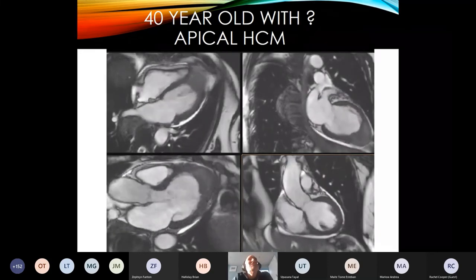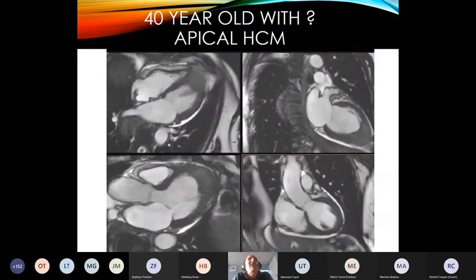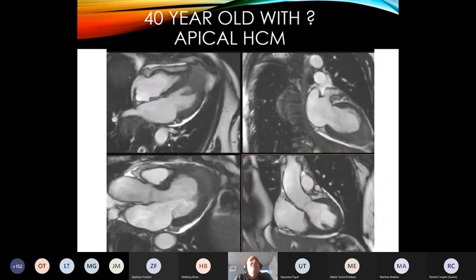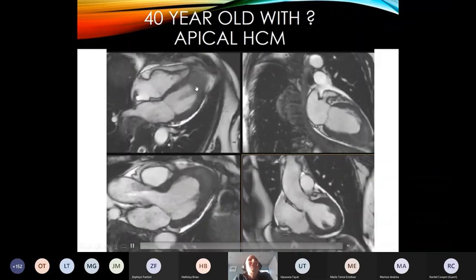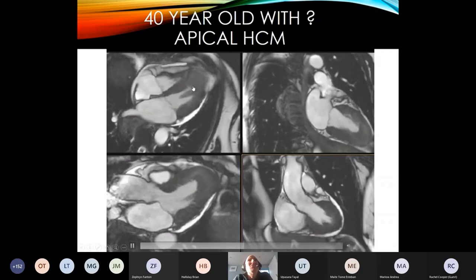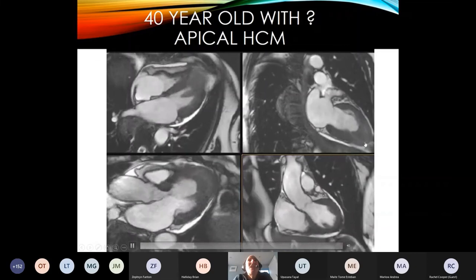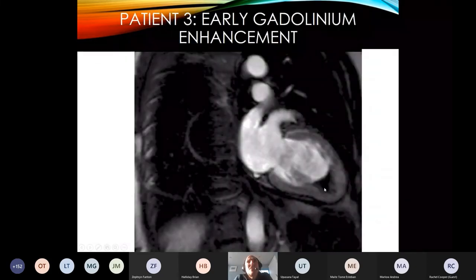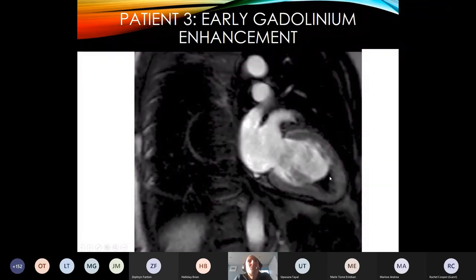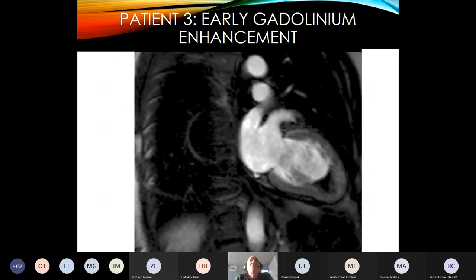This was a rather classic case of somebody thought to have apical HCM. When we put them in the scanner and did this image, it looked odd — you can see why it was originally thought to be apical HCM, it's very thick. There's no visible cavity at all at the apex. But when we give contrast, it's jet black there — so that has taken up no contrast at all. This is all clot. This is a patient with hypereosinophilic syndrome. Such patients get late enhancement in the subendocardium, which becomes very sticky, so all this thickening is actually thrombus, not myocardium.